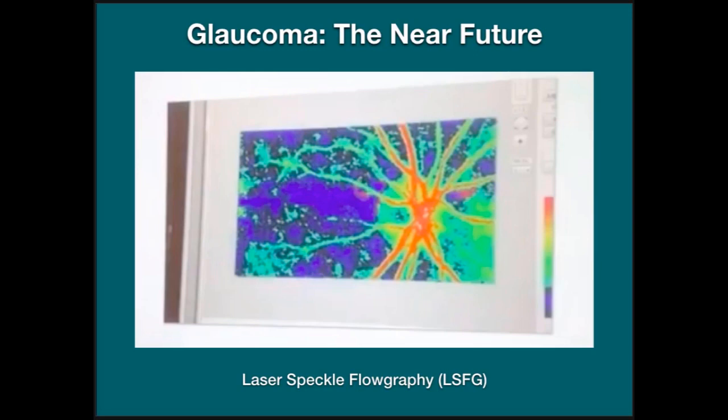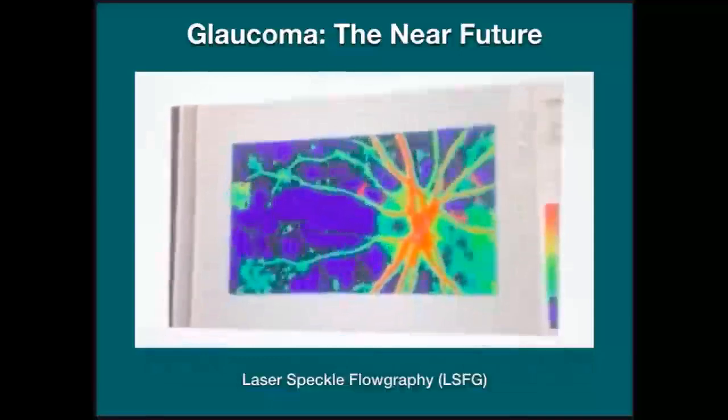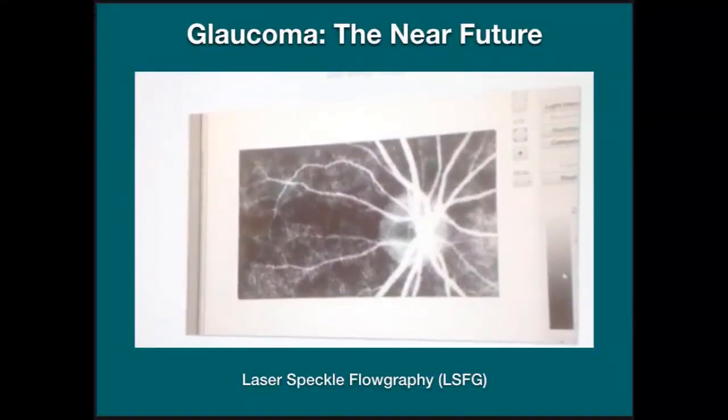So what is the future of OCT angiography when it comes to glaucoma? NIDEK at the moment has prototype instruments of OCT angiography that use a technique similar, as I mentioned before, to the technique of speckle analysis that's used in OCT angiography, but they use something called laser speckle flowography, which is able to detect flow of blood in the eye, not just static images. So I'll click through this little video for you of their prototype, and you can see with each heartbeat how the blood enters into the eye with each pulse, and now in black and white rather than pseudocolor.